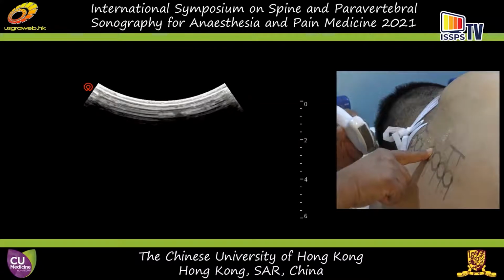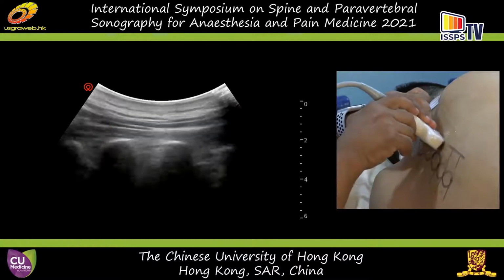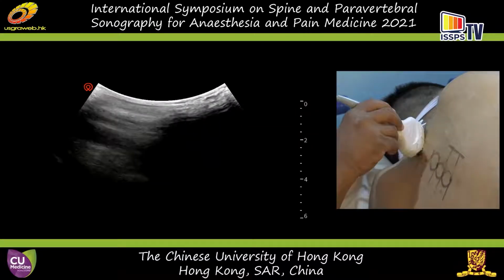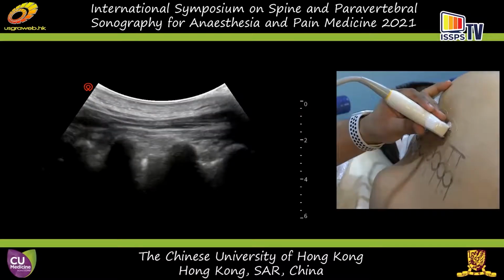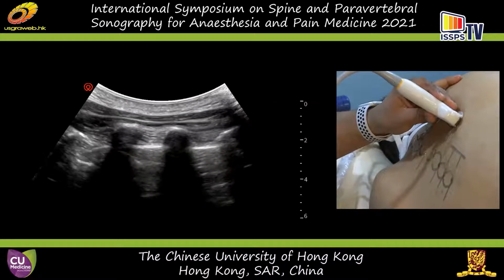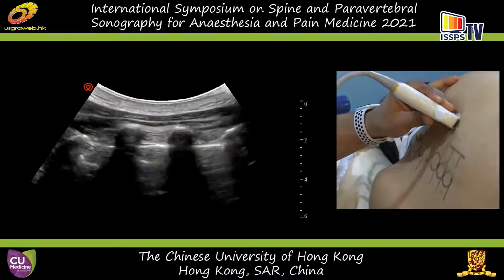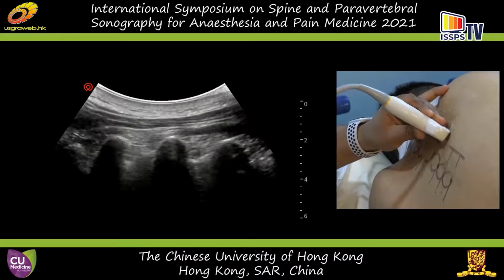But does it really matter, 4 and 5 or 5 and 6? In my practice, it does not. So anyway, we have found that. Next, I'm going to show you the paravertebral anatomy. So we are going to come from the ribs. They are more rounded. The pleura is very clearly visualized. And as we go medially, the rib becomes smaller.